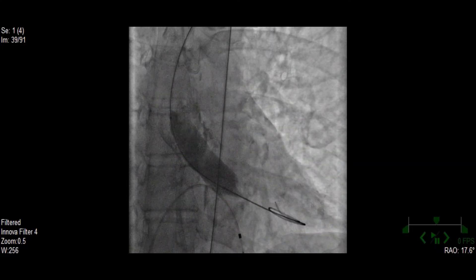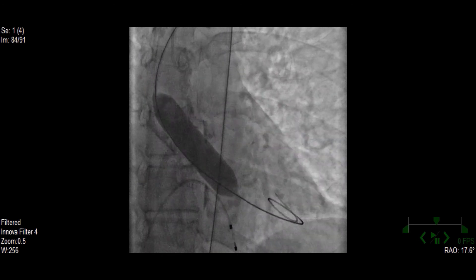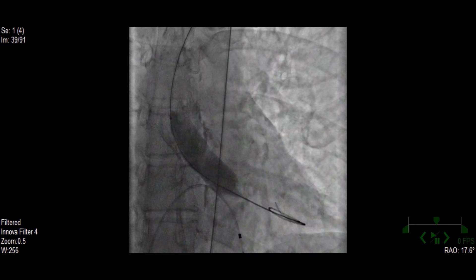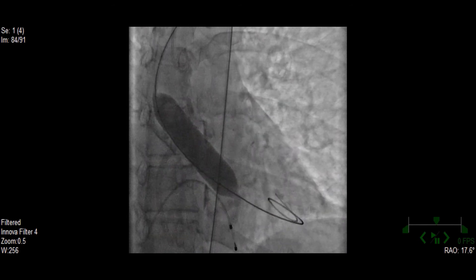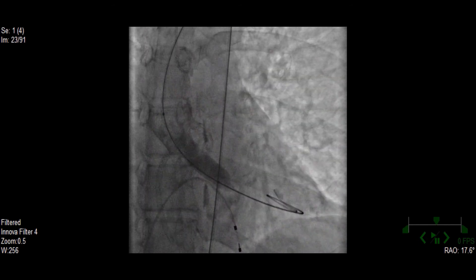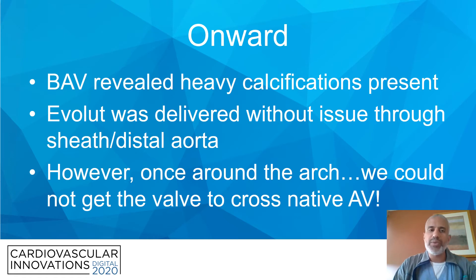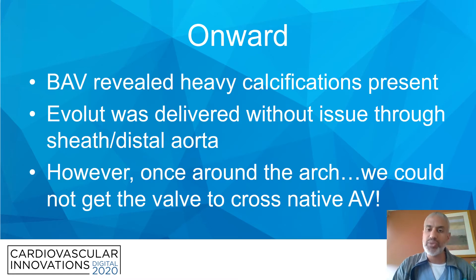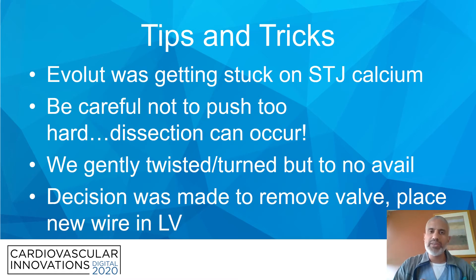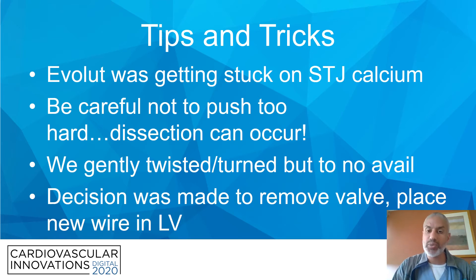Note during the BAV how calcified that ascending aorta is — there were significant calcifications all through the ascending aorta. The BAV revealed heavy calcifications were present. The Evolute was delivered without issue through the sheath and distal aorta. However, once we got around the arch we could not get the valve to cross the native aortic valve. The Evolute was getting stuck on the STJ calcium. We were careful not to push too hard because a dissection can occur quite easily, so we gently twisted and turned but to no avail.